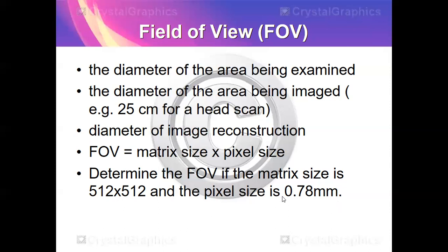So we have here another addition sa inyong assignment. So determine the FOV, matrix size is 512 by 512 and pixel size is 0.78 millimeters.